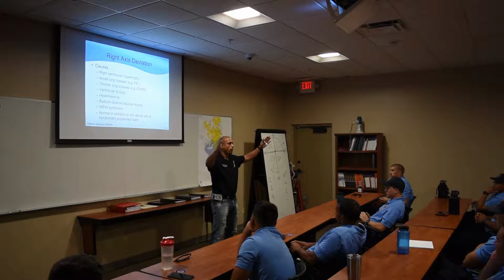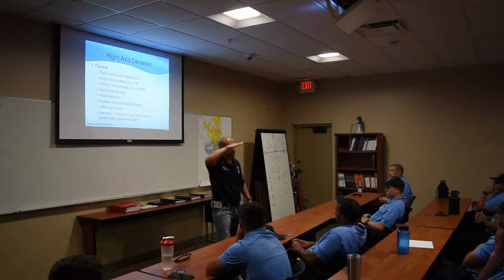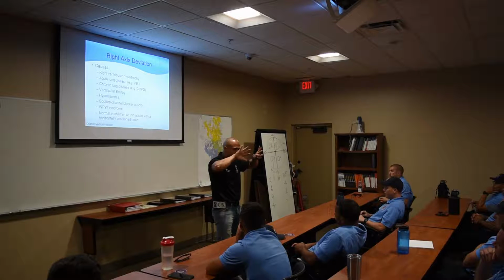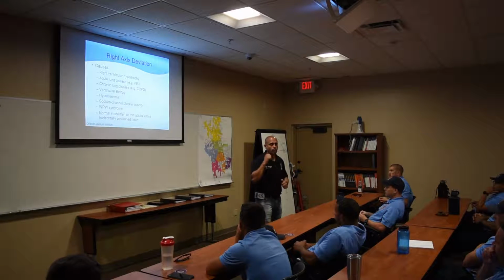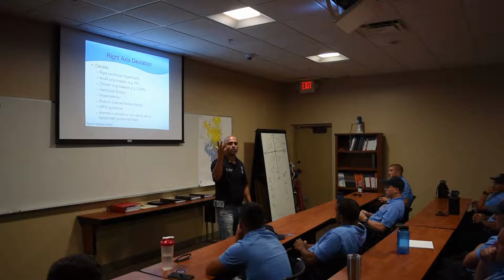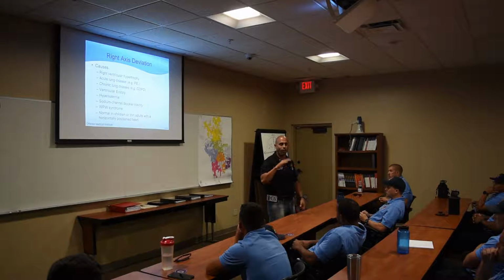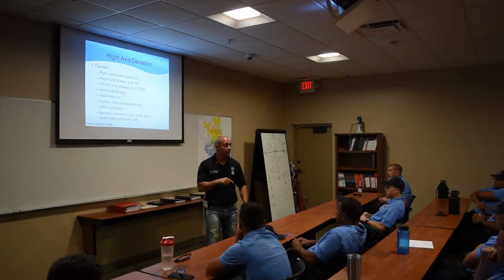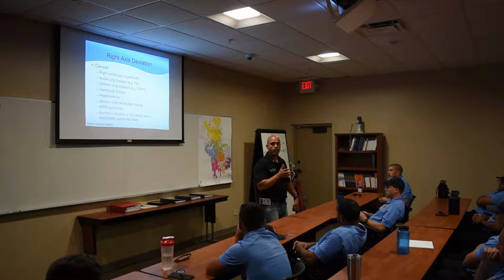What it does, it actually opens up the spectrum, shuts off filters, does it at a higher hertz level versus a lower hertz. Lower hertz, like 40, 30 hertz, actually vectors a little bit more so it can filter better with artifact. Why does it do that? Because small children under the age of 15 all have right axis deviation. Their right ventricle contracts stronger than their left until after the age of 15. So that's normal for a young kid to have right axis deviation. We expect to see that. If we have a small kid that doesn't have right axis deviation, I tend to worry.